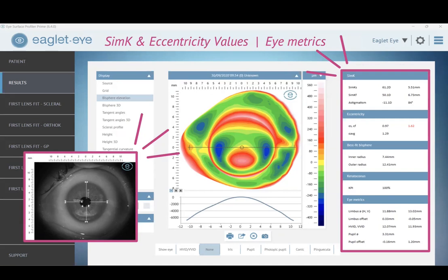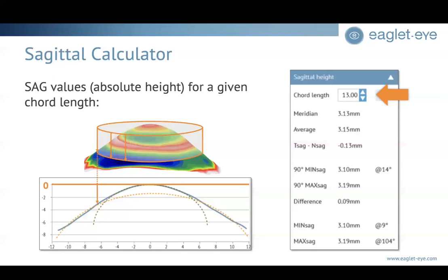There are patients in the clinic that sometimes have failures when we fit them with multifocals, for example, because there can be a mismatch between the location of the anatomical pupil and the visual axis, and then the lens could land in a different spot. To give you a little more information on that, it's accepted, and we see this in the clinic and in studies that look at anatomy, that the pupil is usually located superior nasal. Contact lenses almost always decenter inferior temporal, and so that sometimes can create a mismatch. Using scans like this, we can clearly see exactly what's going on, and pull key metrics from the data to create lenses.